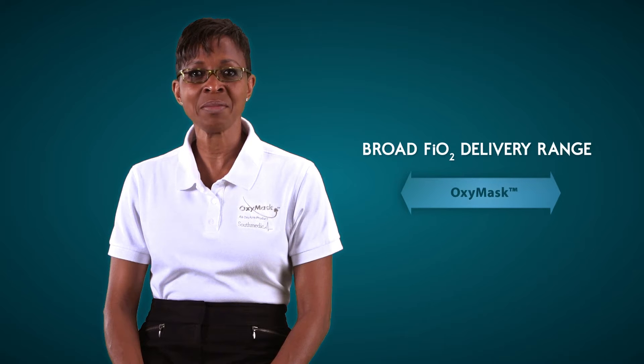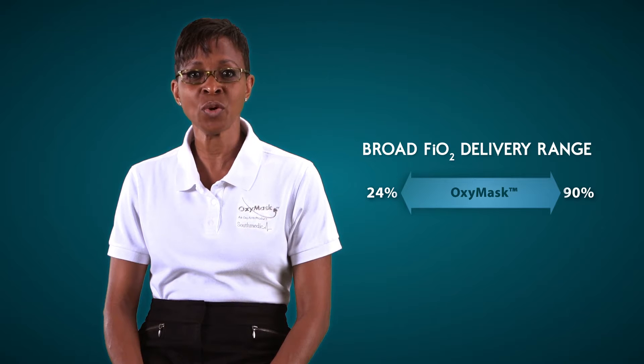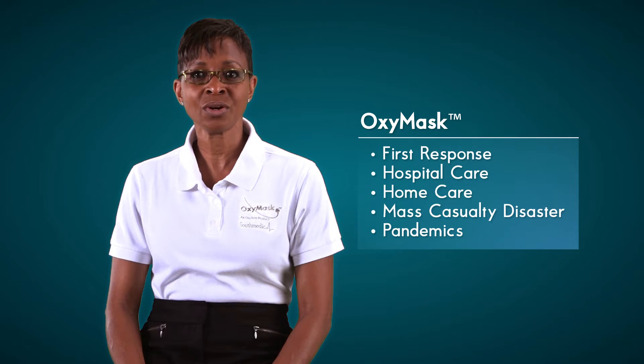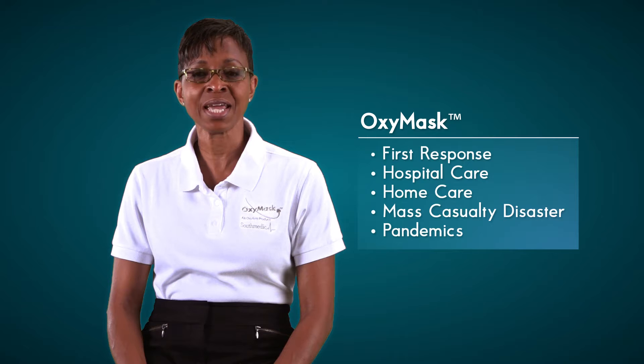The adult OxyMask delivers 24 to 90 percent oxygen simply by titrating the oxygen flow rate from 1 to 15 liters per minute and flush flows. OxyMask is the ideal oxygen interface for emergency first response, acute hospital care, home care, mass casualty disasters and pandemics.